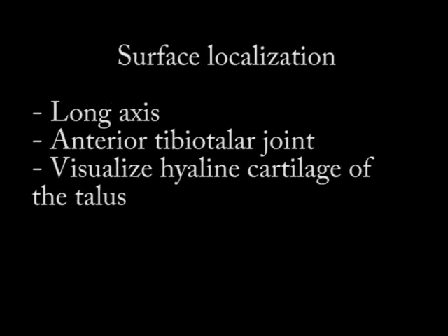With surface localization, there are many ways to start, but you can take your ultrasound probe and put it in long axis to visualize the anterior ankle joint. If the patient doesn't have severe arthritis, you can often see the hyaline cartilage of the talus, which is brought out better with ankle plantar flexion.